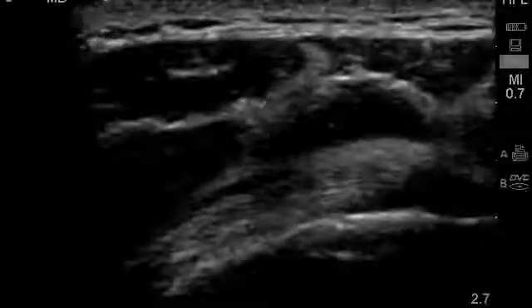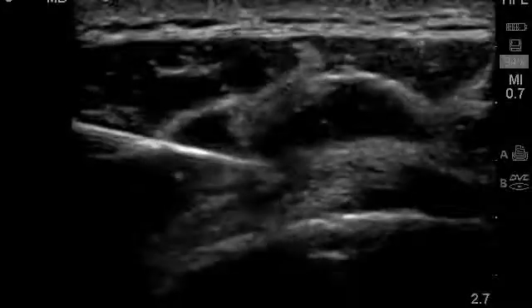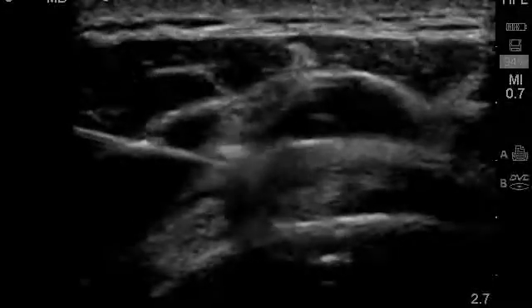You perform an ultrasound-guided injection of corticosteroids into your patient's subacromial bursa. You're able to identify the bursa on the ultrasound screen and to determine the optimal depth of needle insertion for the procedure. The injection is successful on the first attempt.